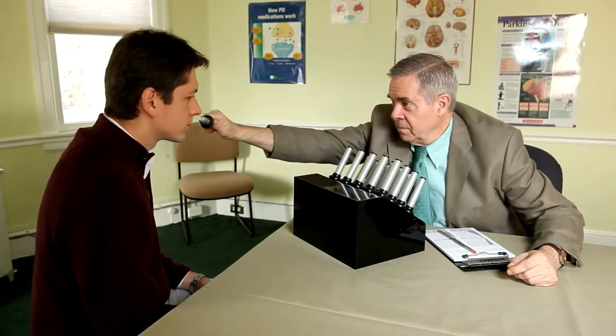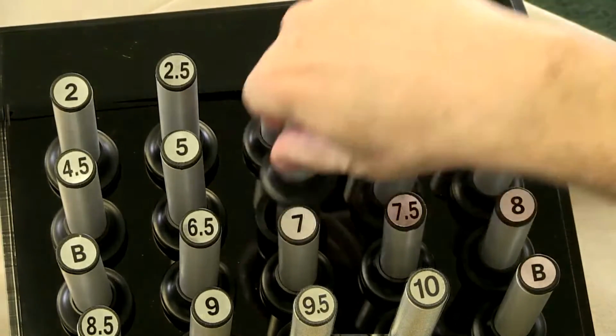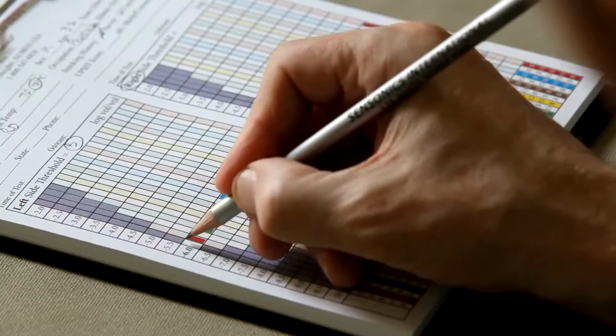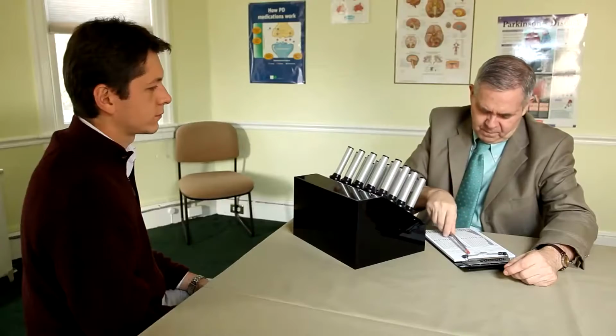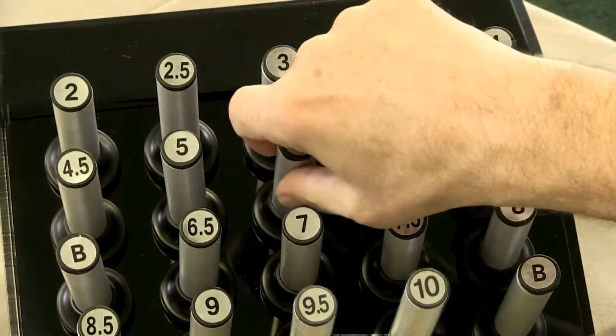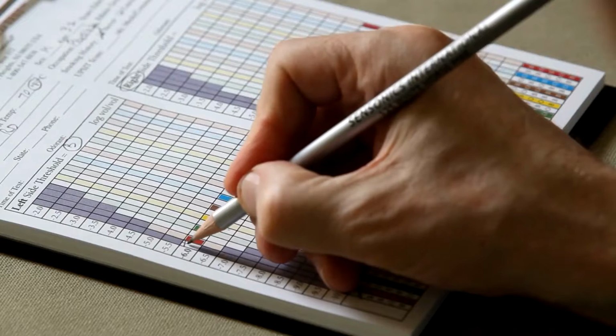Here's the first one. And here's the second one. Which is stronger, the first or the second? The first. Okay, here's the first one. And the second one. The second one. Second one? Yes. Okay.